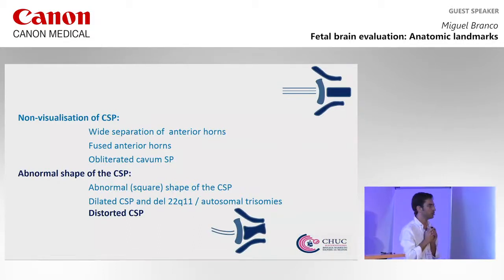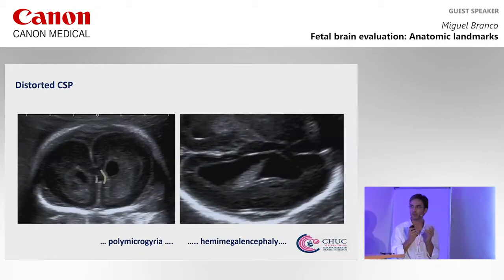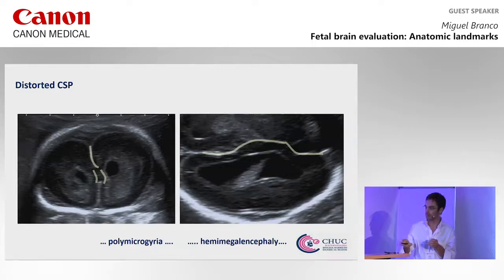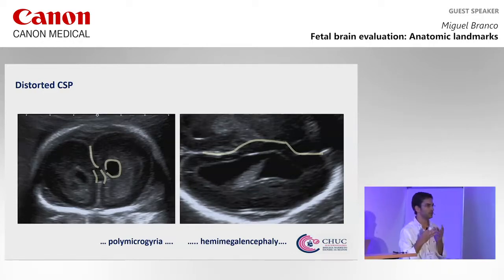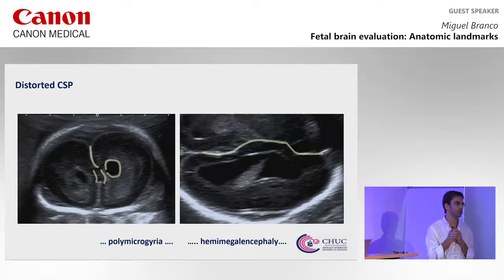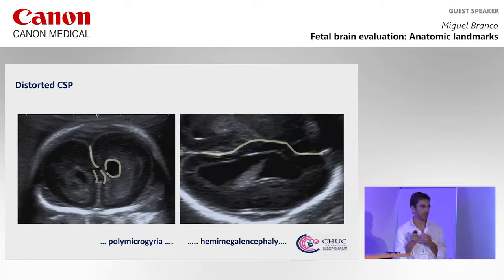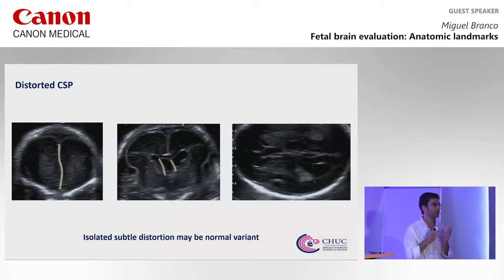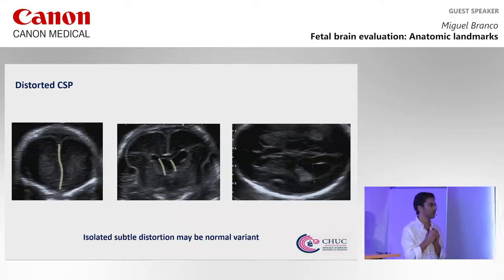The last situation is a distorted anterior complex, which can range a lot. In this case we have a really distorted midline, some heterogeneity, and a rounded anterior horn of the ventricle — very suggestive of malformation of cortical development. In this case it was hemimegalencephaly and polymicrogyria. On the other hand, we can have more subtle distortion of the anterior complex, and if everything else is normal, that situation is also normal.